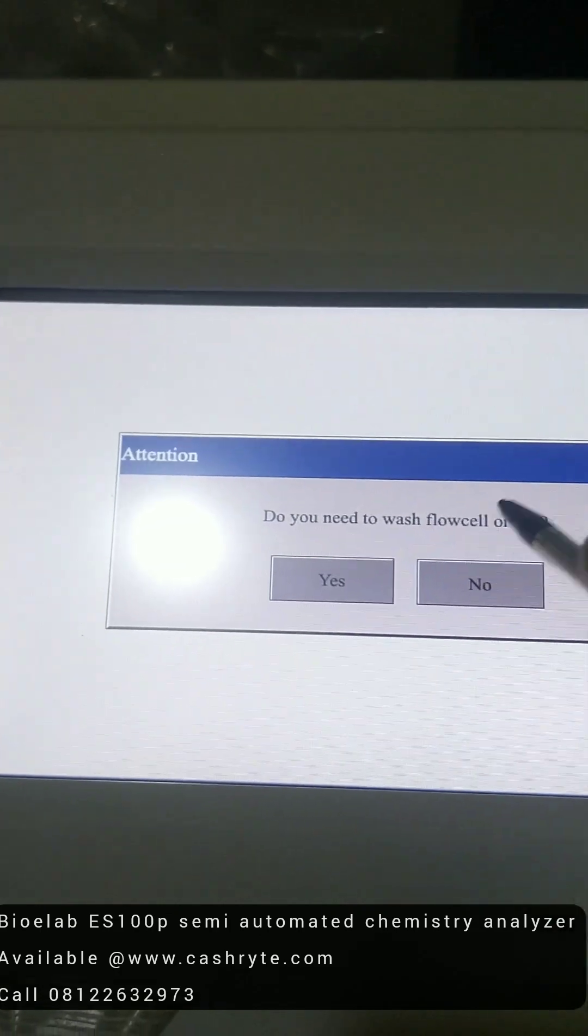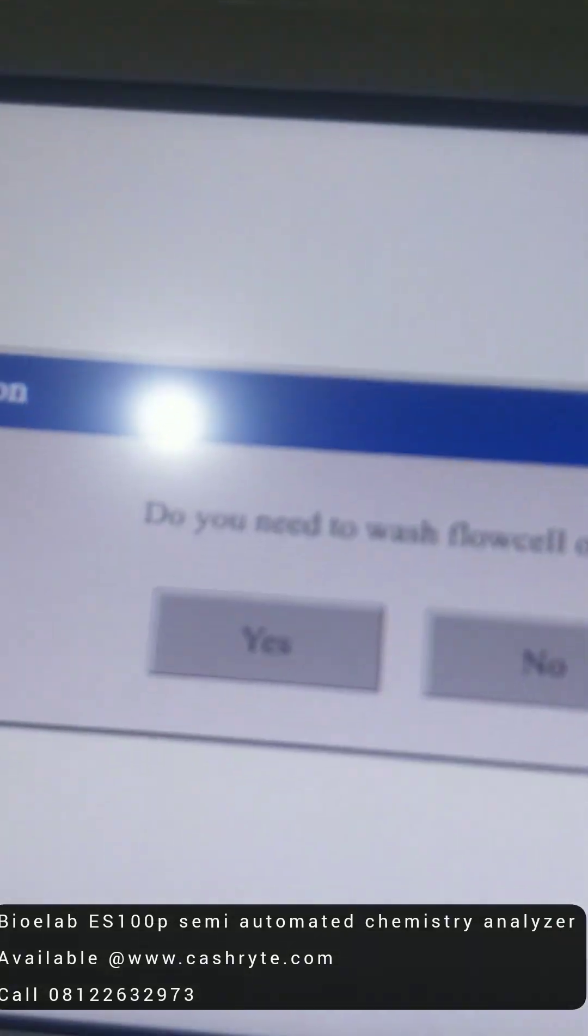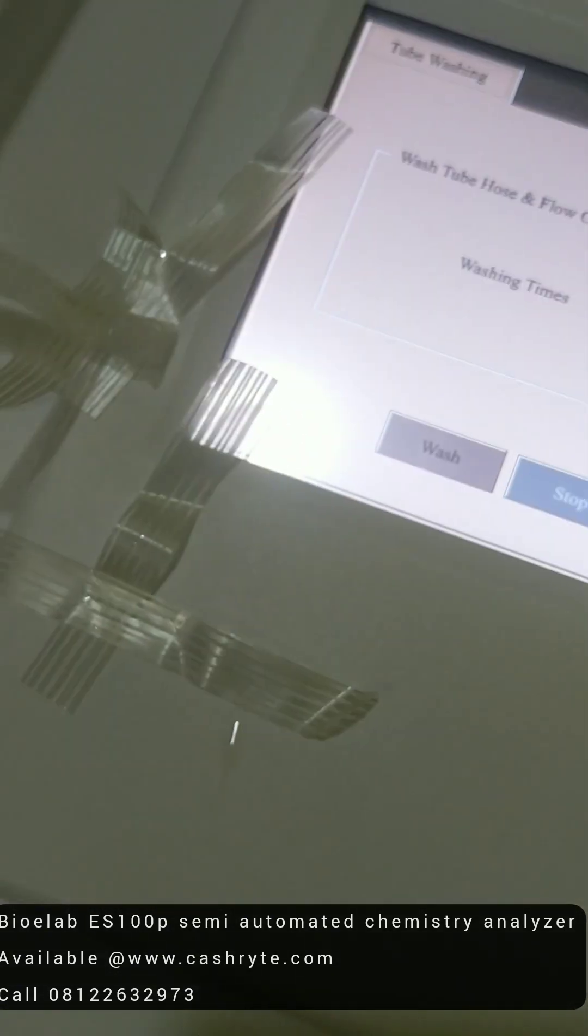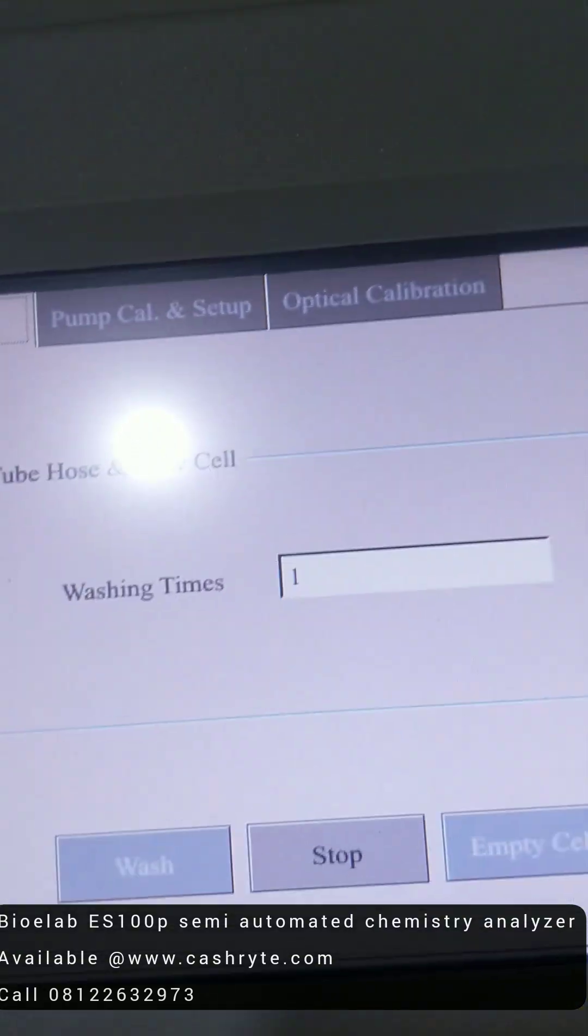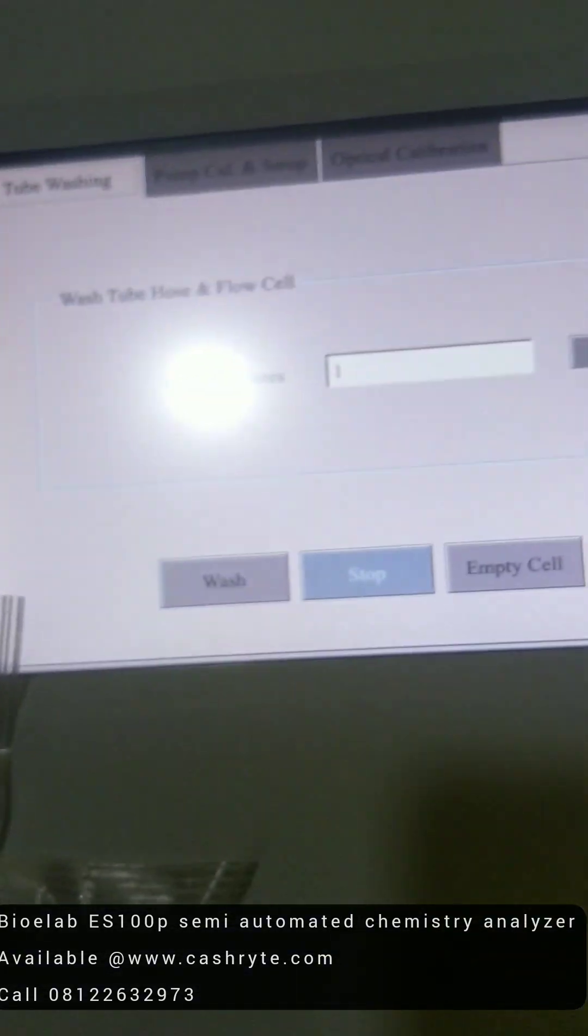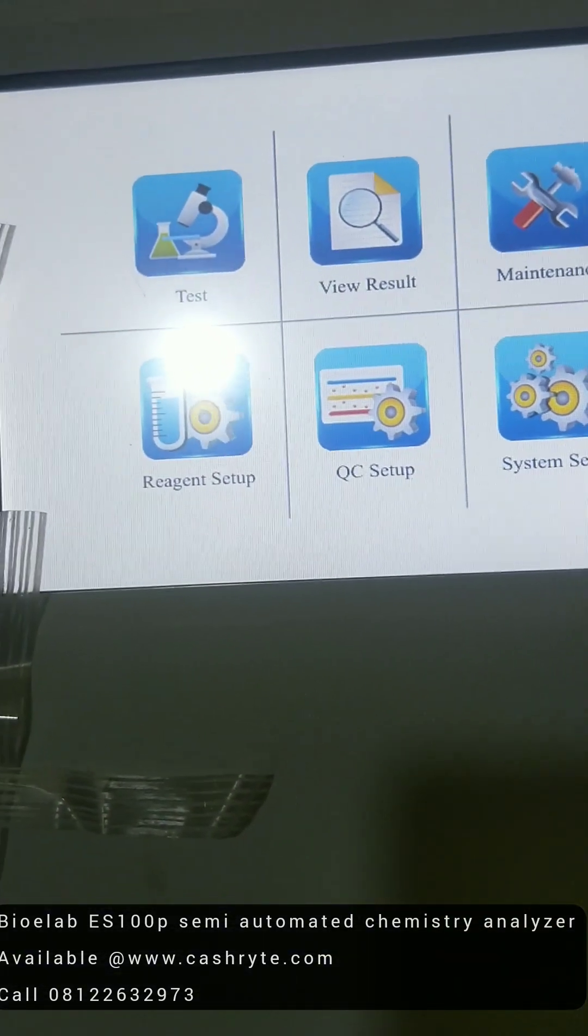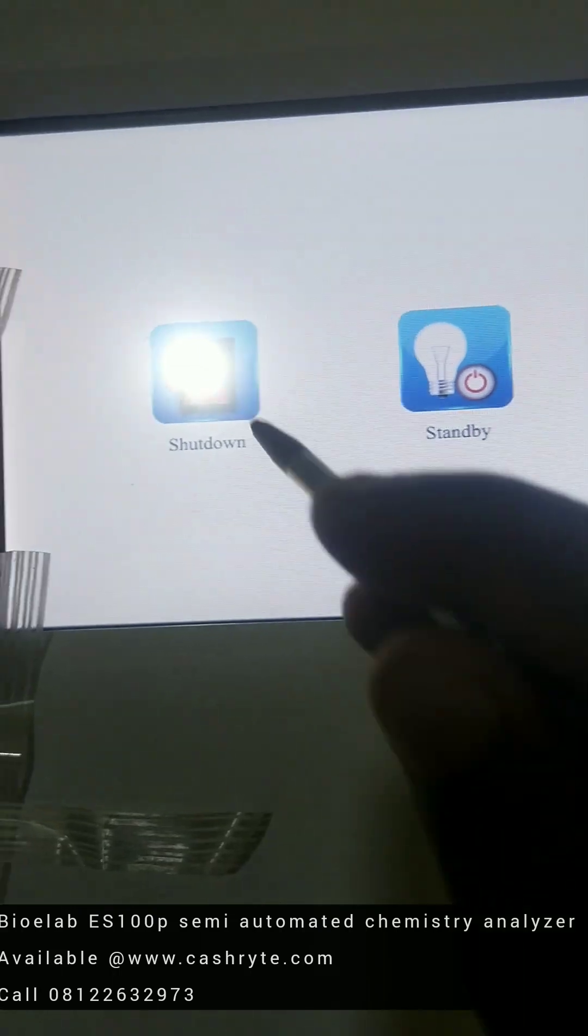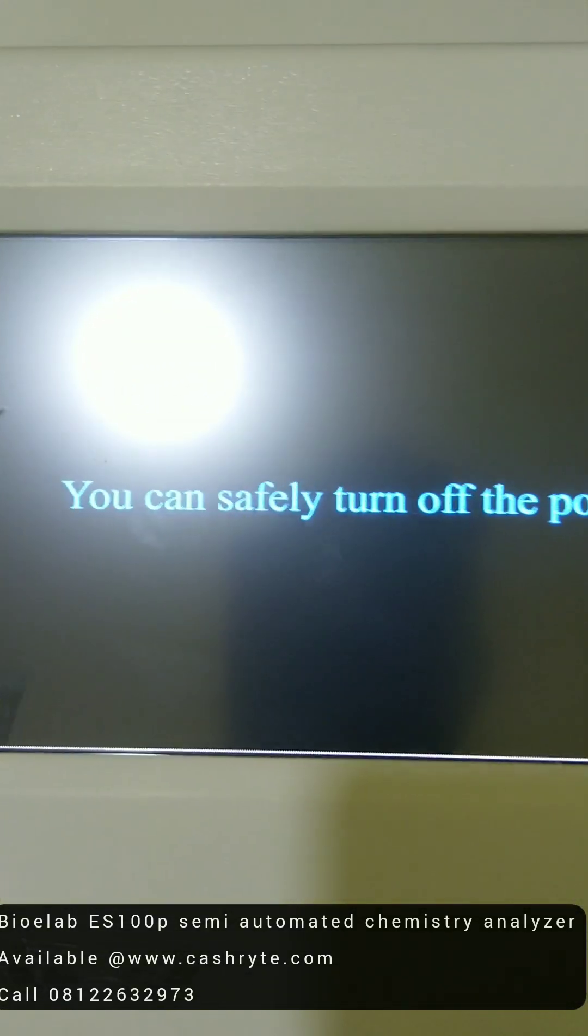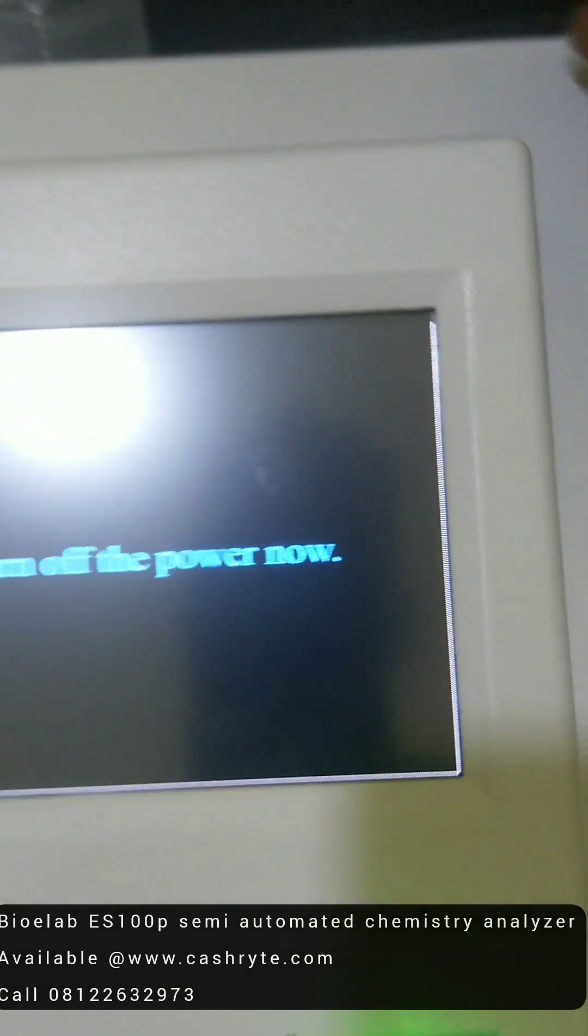Then to power off, you power off here. You need to wash the flow cell. Here, you say yes. Then you wash. Yes. Then return. Say no. So you can return on before.